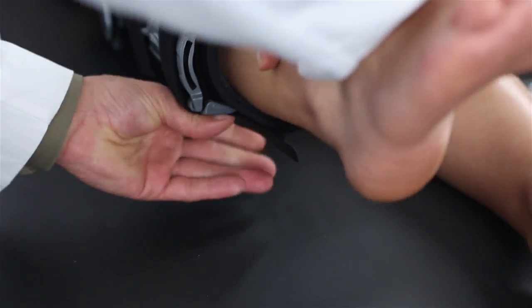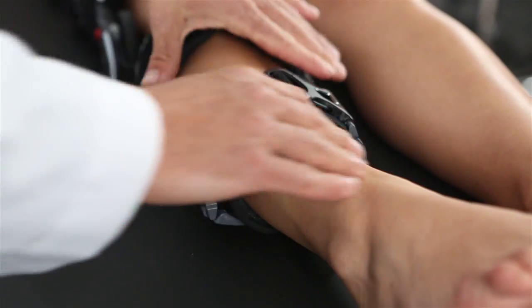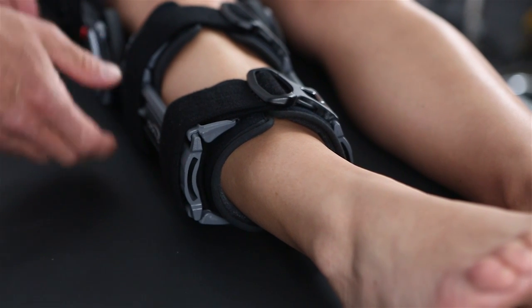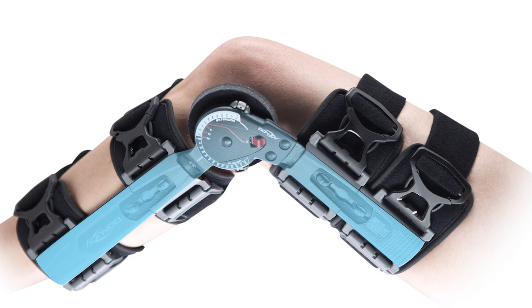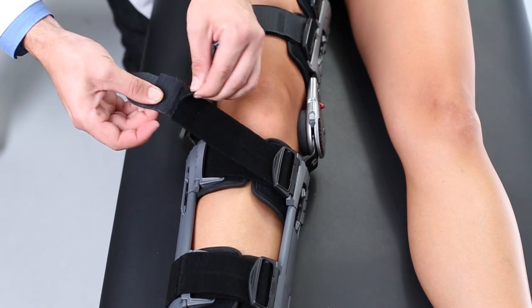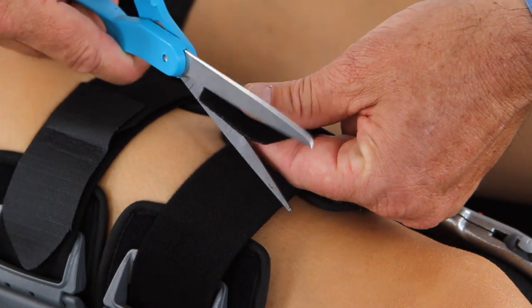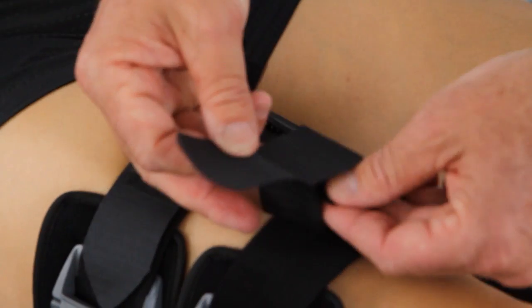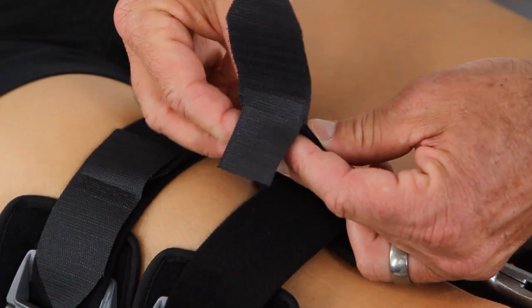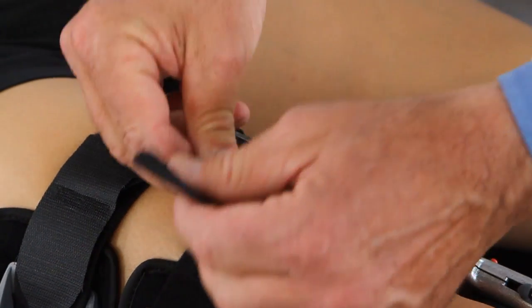In other cases, the strap may be too long or it won't Velcro securely. In that case, properly align the uprights at midline of the leg. Then remove the alligator Velcro strap end. Either cut the excess strap with scissors or fold it under. Then reapply the alligator strap end so that the strap end is on the anterior portion of the leg.